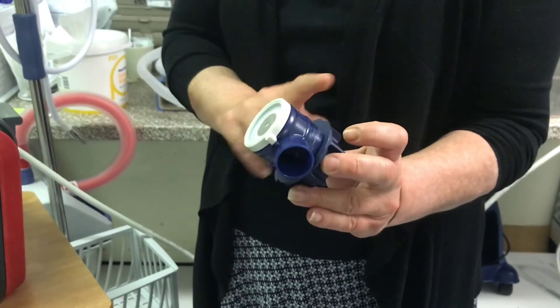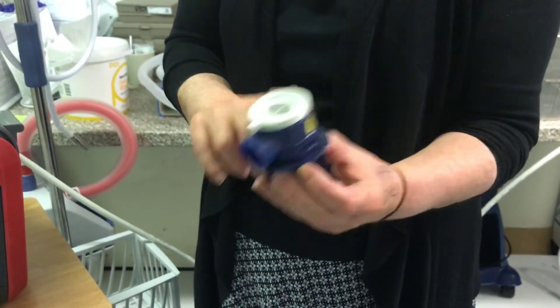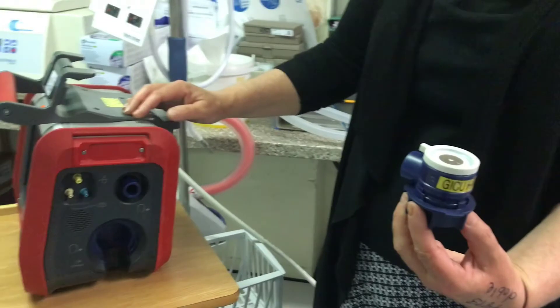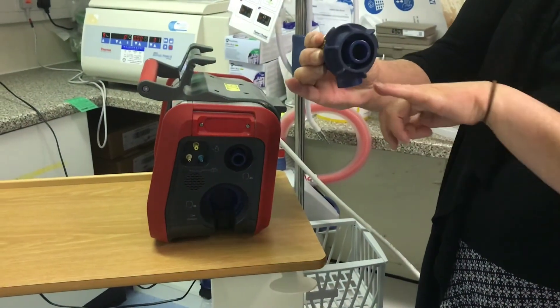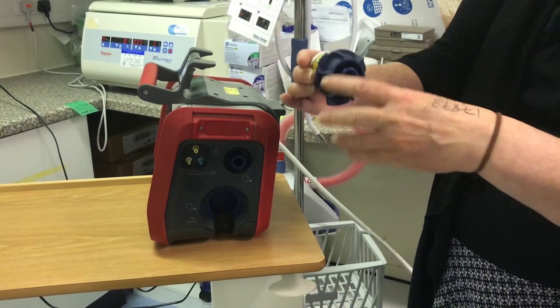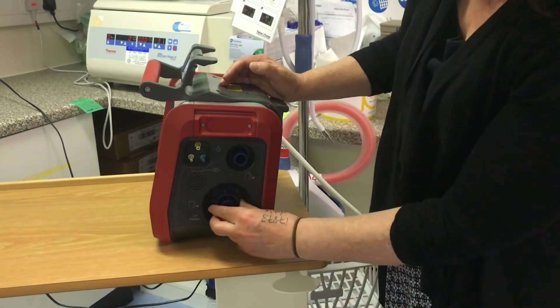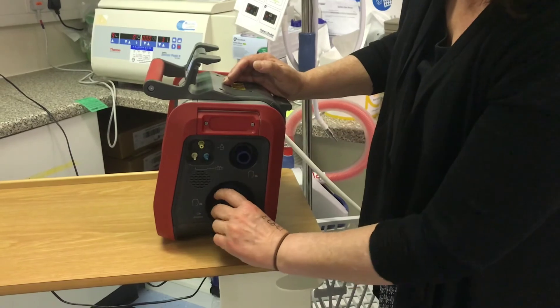However, the technicians should be putting these back together, so when you collect a valve, it should be ready to go. To put back into the ventilator, we just make sure that the port is downwards, and then push into the ventilator, click to the right.